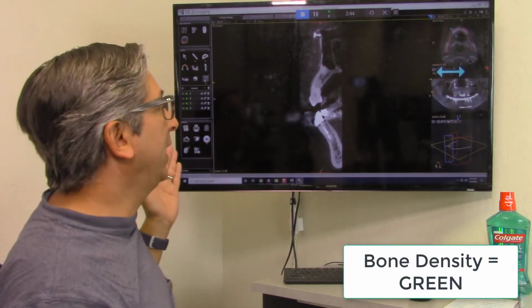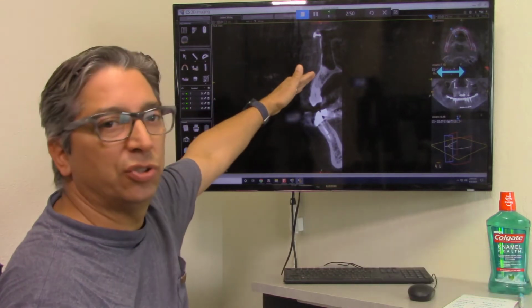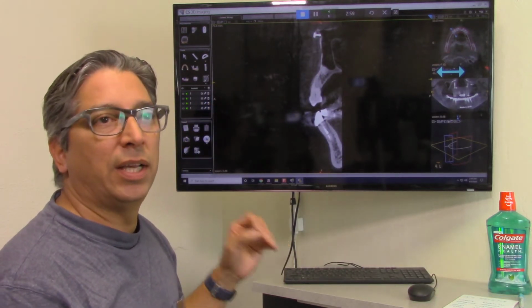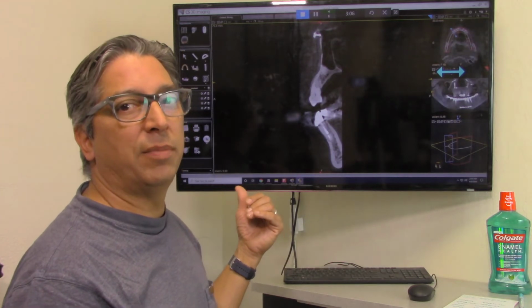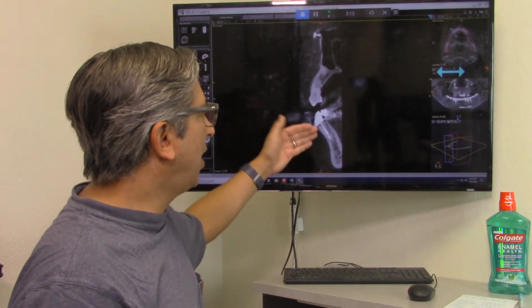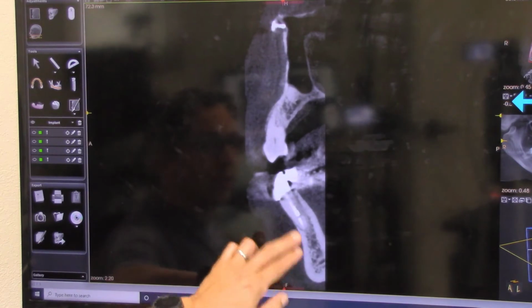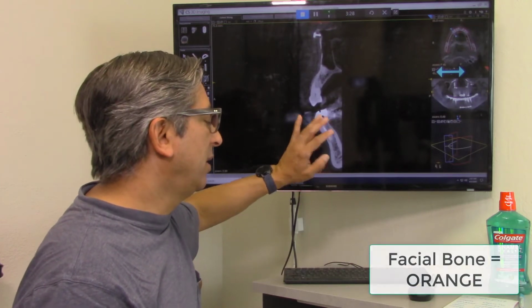The bone density is okay, but the constriction problem, there's a red sinus, there's attached tissue issues up there on the sinus in the posterior area. The ability for that area, when there's such thin bone, is nearly impossible to really grow bone. You'd have to have a lot of miracles happen in growing bone into those areas there. On the bottom has a little bit of constriction, has thin facial bone, but when we scan along in this area here, there's still some bone here. There's a little bit more bone here than it actually shows. So I don't give it a complete red, I maybe give it an orange.